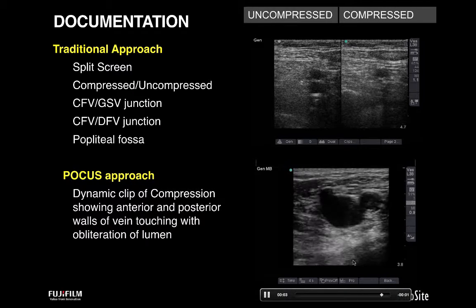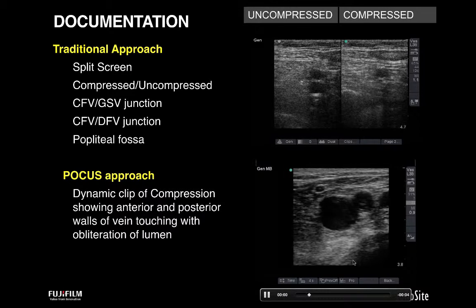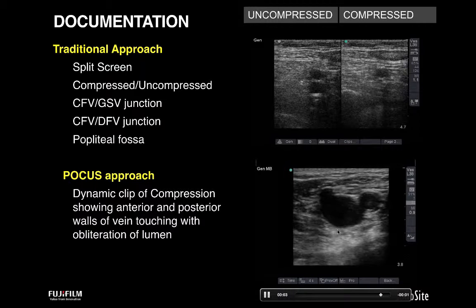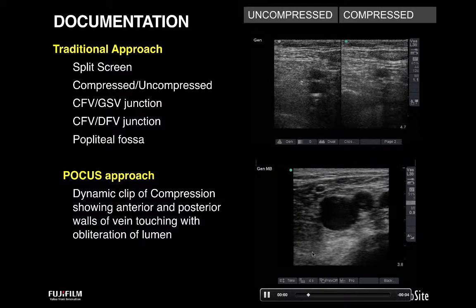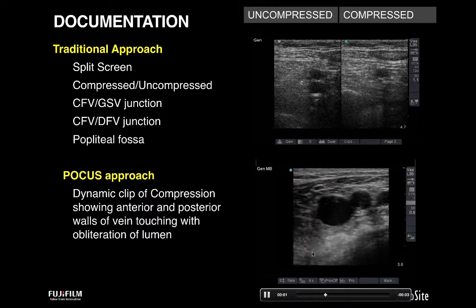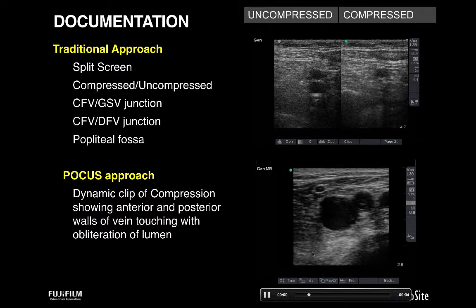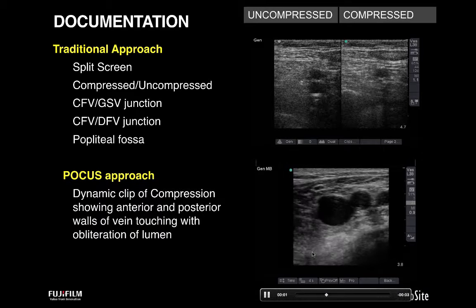The reason why is, in some early clots that are somewhat soft and gelatinous, you can compress them if you use a lot of pressure. So I try to use somewhat light, a little bit more rapid pressure than you're seeing in this example, just to see the two walls bounce off of each other. Again, more chronic DVTs that appear rather highly echogenic will be much more unmistakable. But some of the early hypoechoic gelatinous clots, if you press really slow and hard, sometimes you might conclude that there's not a thrombus there.